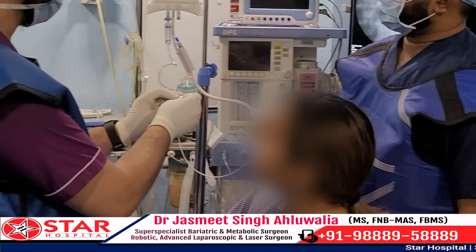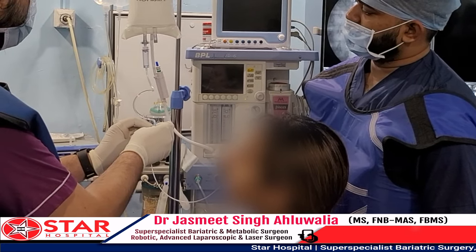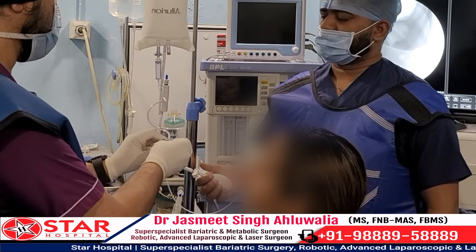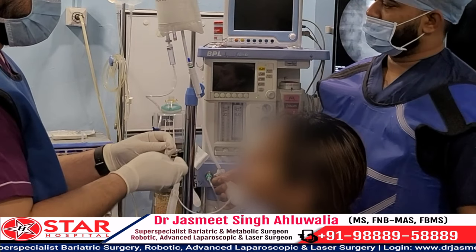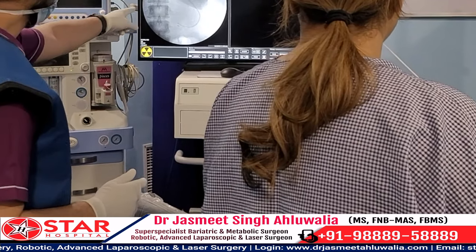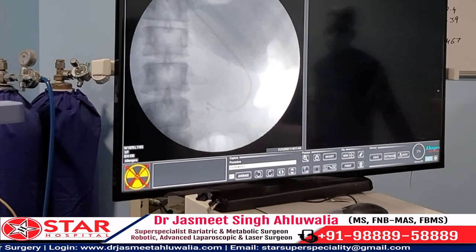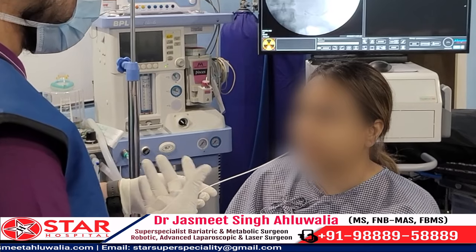Within a very short span of time the whole fluid bag is empty and the entire fluid has been transferred into the balloon inside the stomach. This filling has taken around three to five minutes. We then lock it and check the balloon once more to see the filled balloon inside the stomach before we detach the catheter. Once ready, we ask the patient to hold her breath for a second.